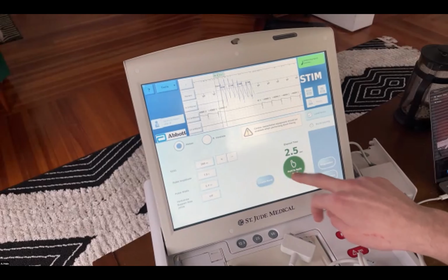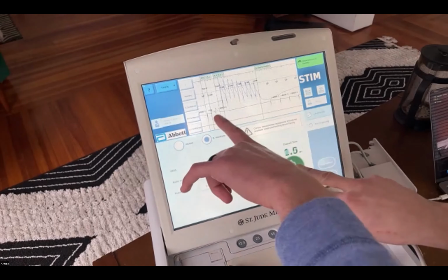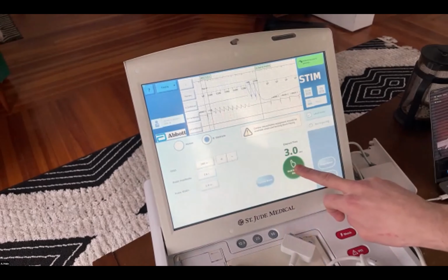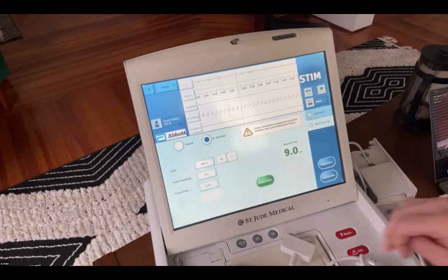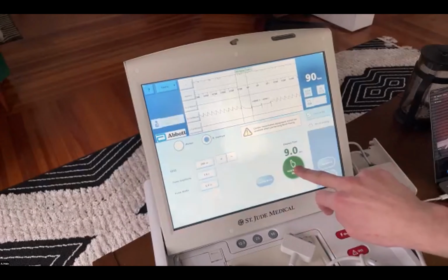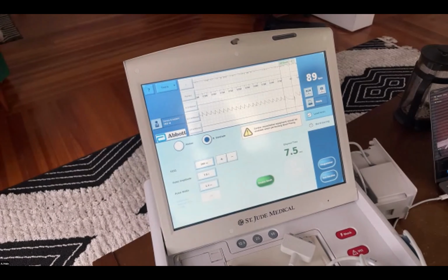In this case, it's pacing the atrium. This will then pace faster than the intrinsic rate, allowing us to hopefully gain control of the myocardium, control the refractory and break up the arrhythmia. However long you hold it is how long it's going to go. Sometimes you'll get it in 5 seconds. Sometimes you'll need to run a whole screen, which is around 8 or 9 seconds. But those are the ways you kind of pace out.